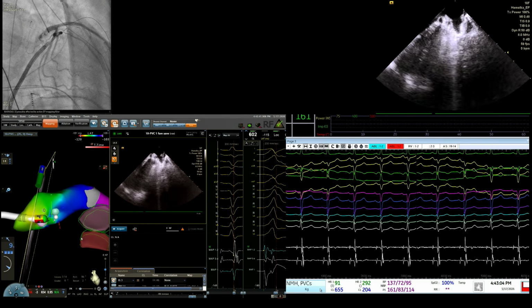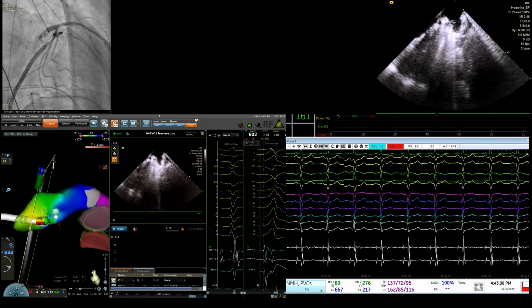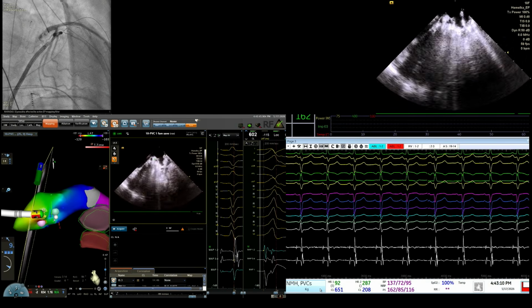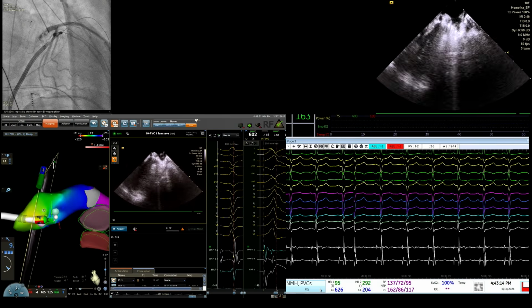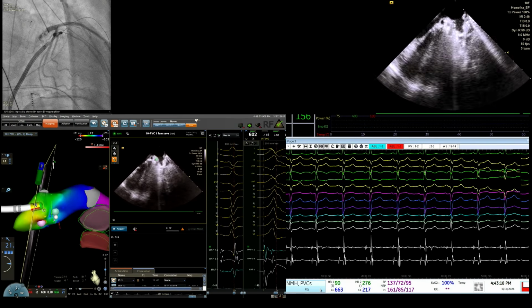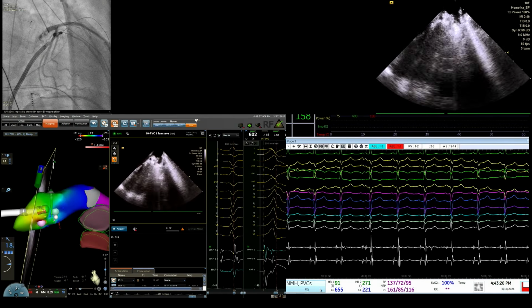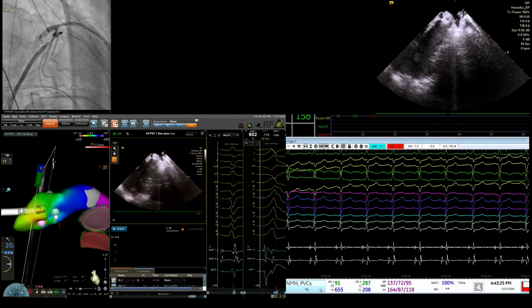Yeah, whatever is the maximum, 17 or 20. Mechanical. Yeah, the pressure might be suppressing it because we haven't seen it, but maybe if I release a little bit. Sometimes it's a higher heart rate, so it's faster, but no, it could be even pressure, right? Yeah, you could be having mechanical pressure.